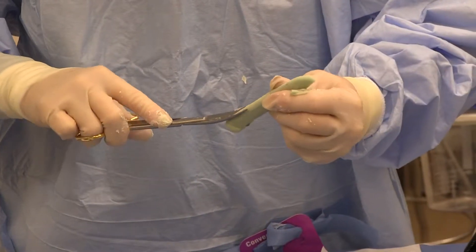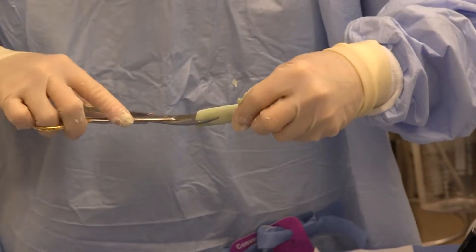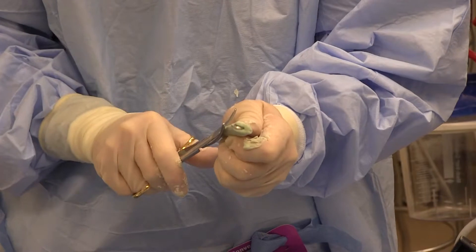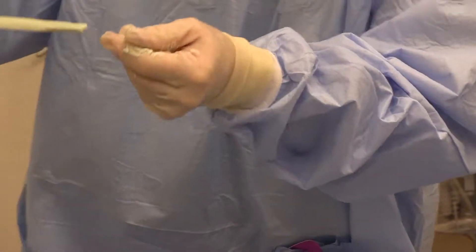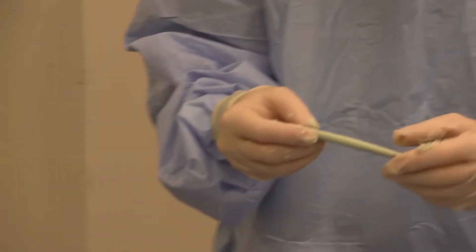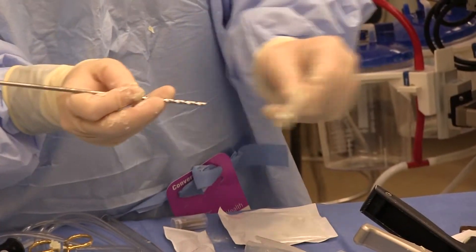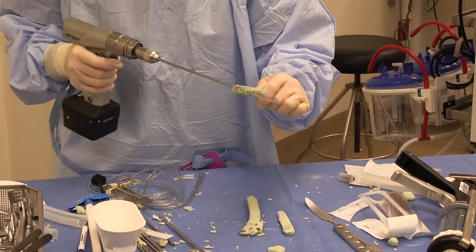Let's go to the little plate. Because it was such a big tube and because this was a little plate, I think the cement coating will be thicker than the other ones. You can always fool around with this a little bit more and put something heavier on it. Here's this plate — it is a little thicker. For these screw holes, I will need to drill these out. The other option is to drill them out even when you're right on the patient so that you just drill them out once. Here we are with the power — we can drill these out.